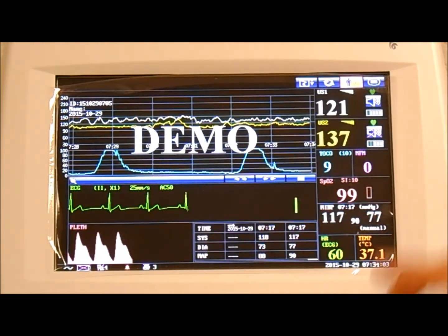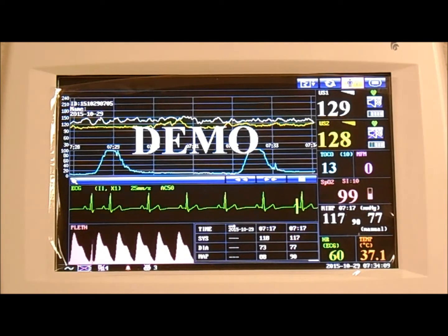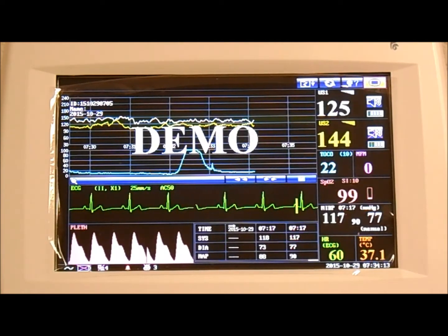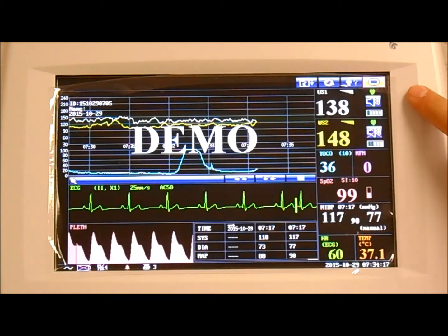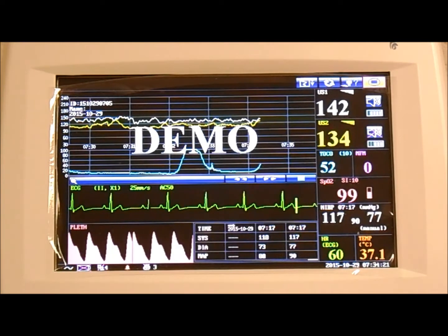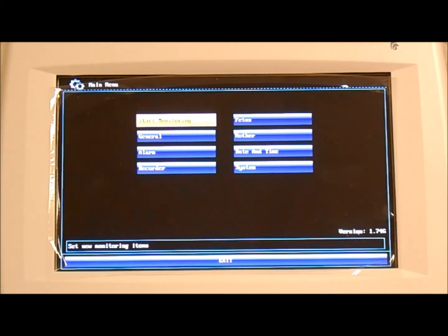And to the right we have the patient information icon. At any time, if you want to adjust or modify the name of the patient or the ID, press on it and you can enter that information. And the icon that's all the way at the right, it's a square with a line going around it. That's your menu icon. So let's go over your main menu settings.